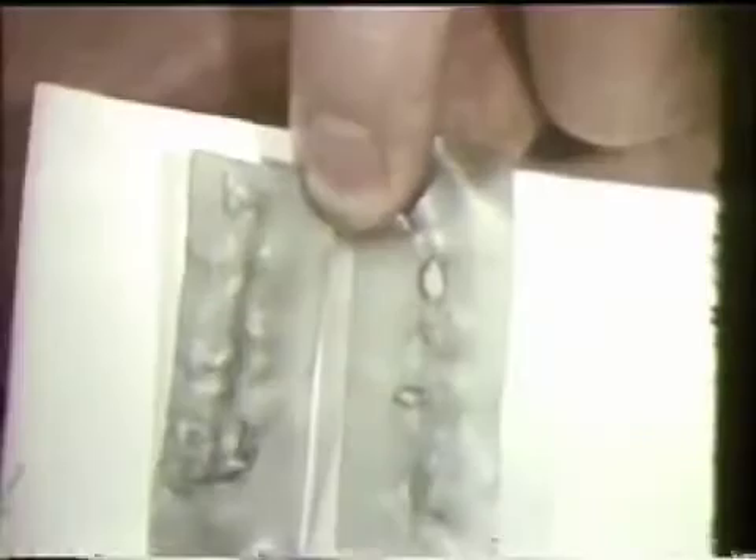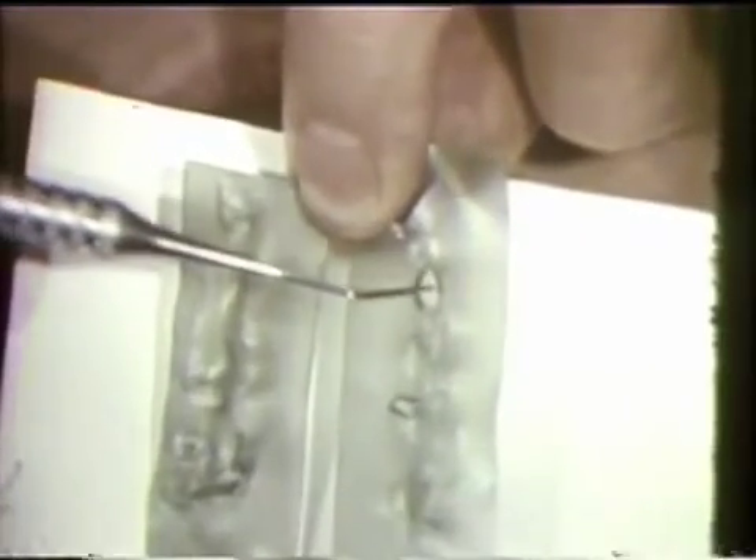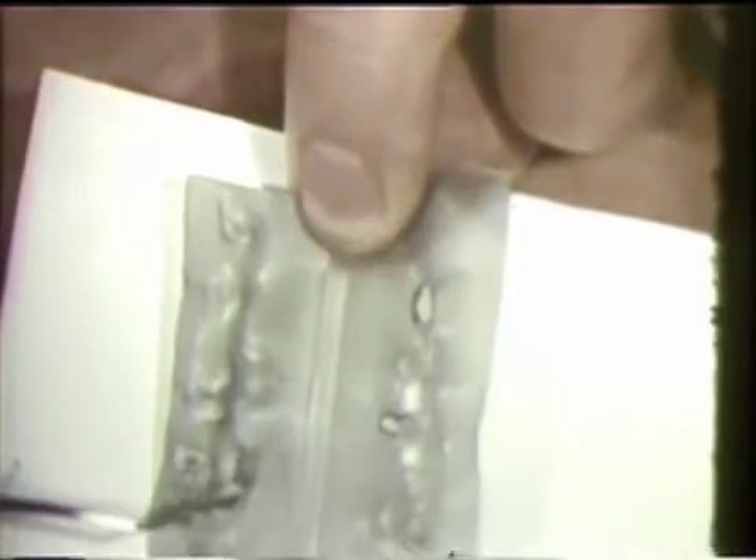Casting wax is again used. This time the patient is instructed to move the mandible to the left from centric occlusion. The penetrations indicate working side contacts on the cuspid and the first molar, and balancing side contact on the right second molar.